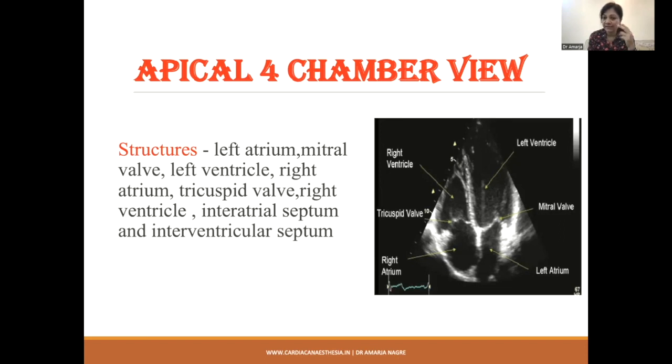Fine. There are two things which will distinctly say that this is the right ventricle. If I say globular and apex forming, you may get confused and may not even be convinced with this. But now the two convincing signs: the right ventricle will always have a whitish, rope-like structure, which is the moderator band. So a moderator band is always present in the right ventricle. The LV doesn't have this moderator band, and in the RV, it is distinctly seen in all the patients.